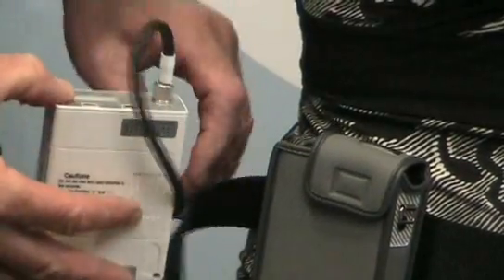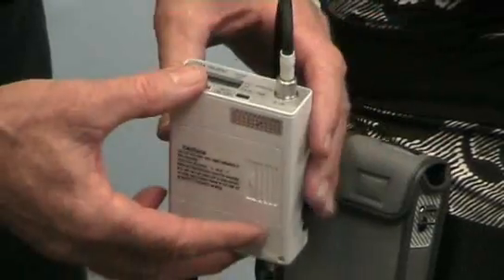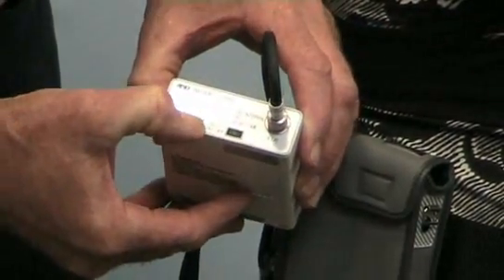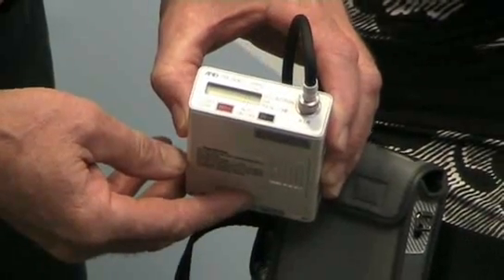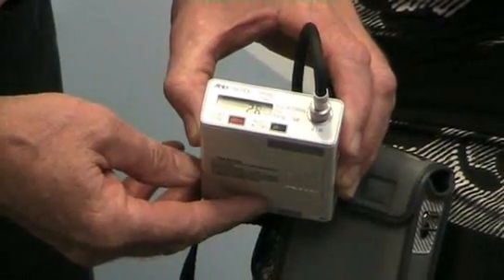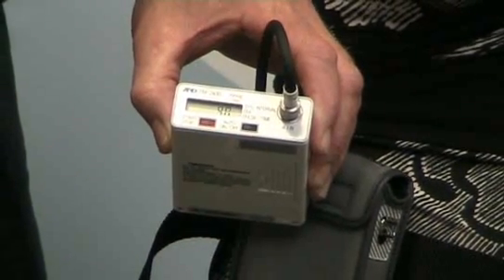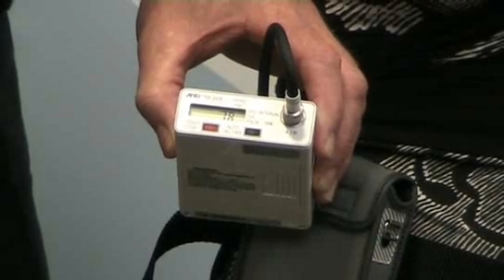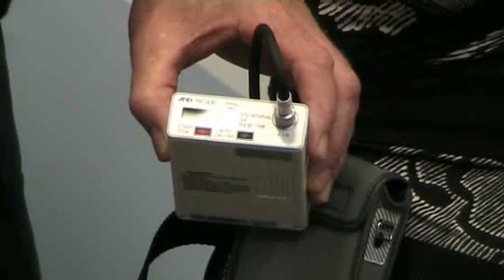Before the patient leaves, it is only reasonable that they should know what to expect when the monitor starts inflating. So we can produce a manual inflation by just pushing the orange button, and in about 40 seconds it will complete inflation and deflation and produce a reading, so the nurse or doctor can check to make sure the batteries are working correctly and get a guide to the first reading. This will inflate to 185 millimeters.